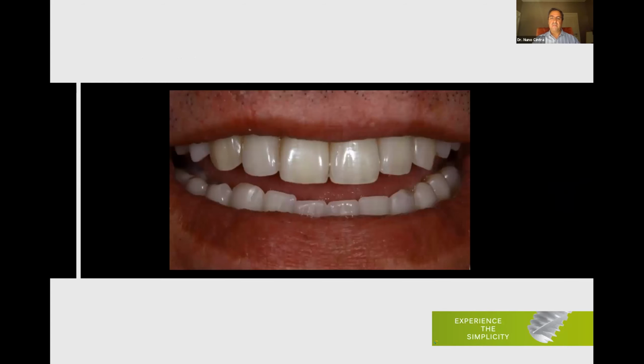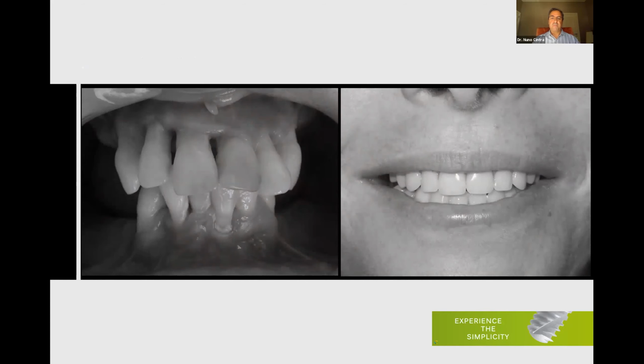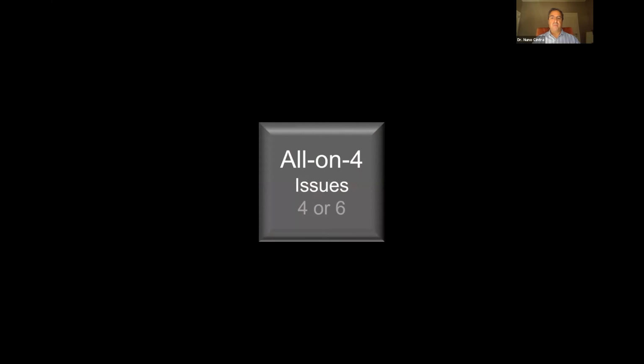Situation like this. From this to that. This is an acrylic bridge, works very well. Most of my patients go for acrylic. From this to that. Now, let's start with the issues. 4 or 6, well, that depends on the amount of bone.